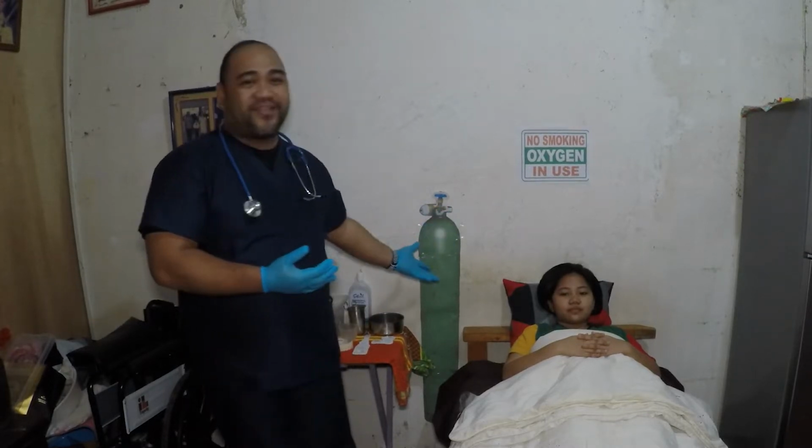There is therapeutic oxygen, which is available from two sources. One is the wall outlets, and the other one is the oxygen cylinders. This is the one that we'll be using today. So, in order for you to do the procedure, you have to take note of the following.